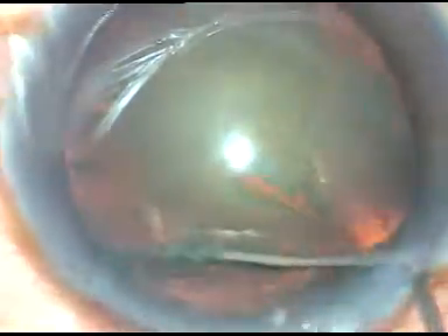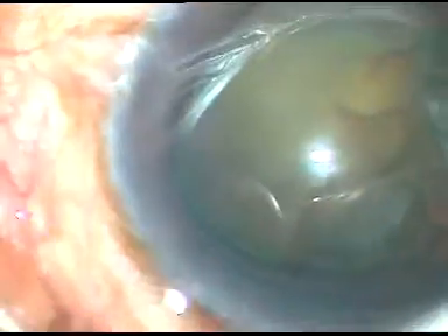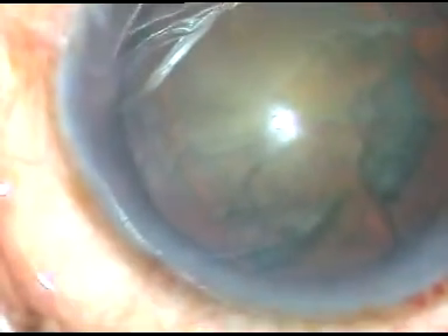Hydrodissection and hydrodelineation done. The nucleus is rotated gently. It is not rotating very freely, but it does not matter.